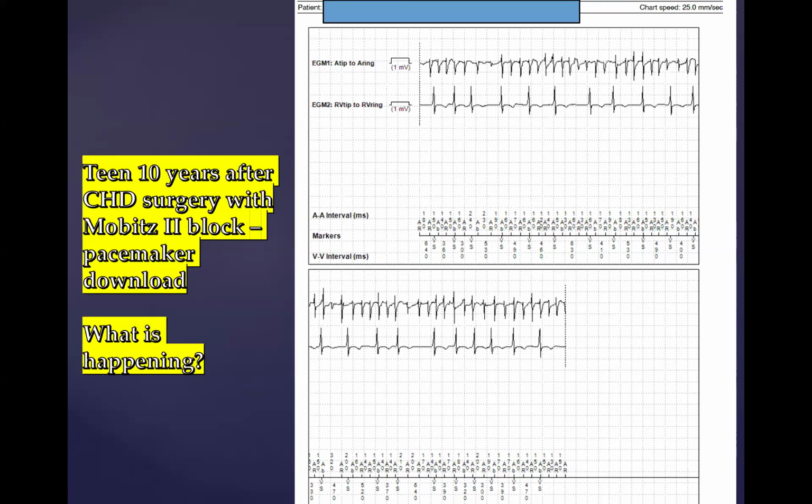I would think around 100 or 150, if you're having true RVR. Probably closer to the 150s because you're a healthy person. You have a good AV node, but it would not be 300, right? No. But my point is this person's ventricular rate, I guess the slowest is near 100, so I guess it's around 150.